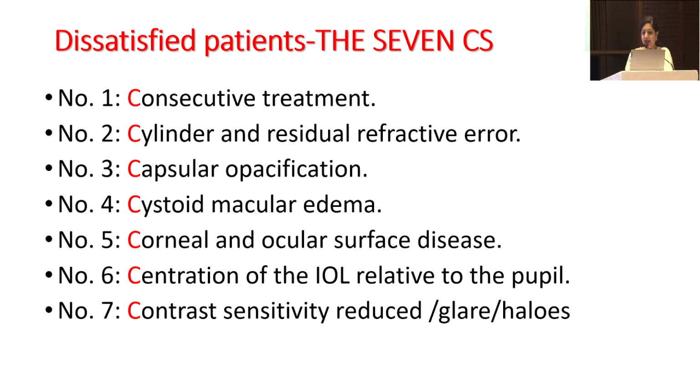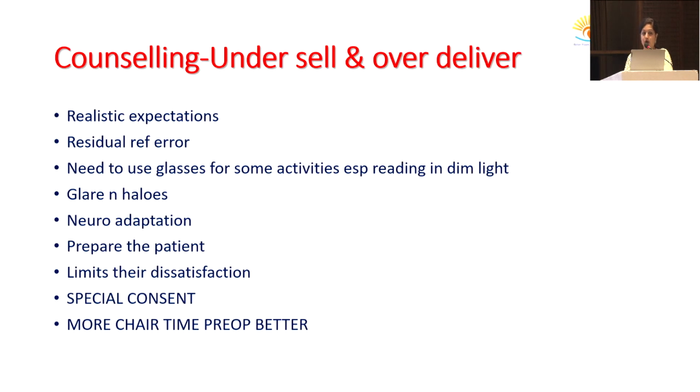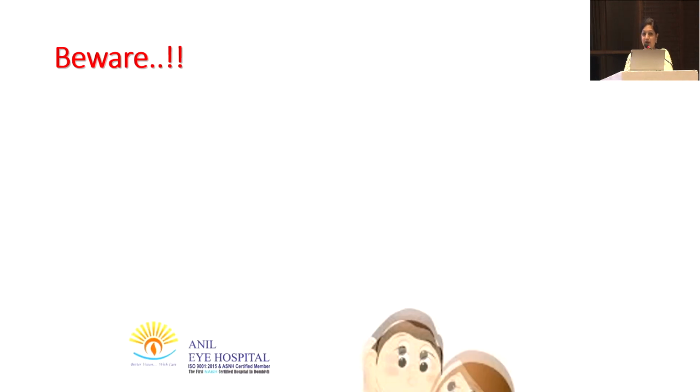And yes, there could still be glare and halos, because in diffractive IOLs, we know 18% of the light is going to be wasted. So counseling of patients is important. Always undersell and overdeliver. Thank you very much for your kind attention. And I always feel that our multifocal patients are like your lovely wife or husband. You give more time to him, and he'll make life heaven for you. Otherwise, it can be life hell for us.